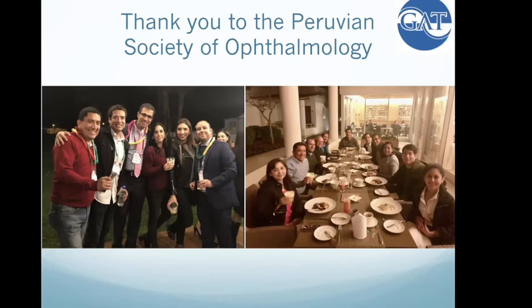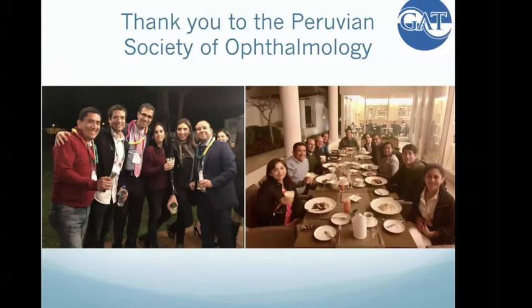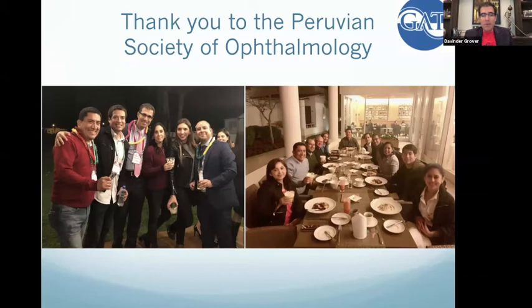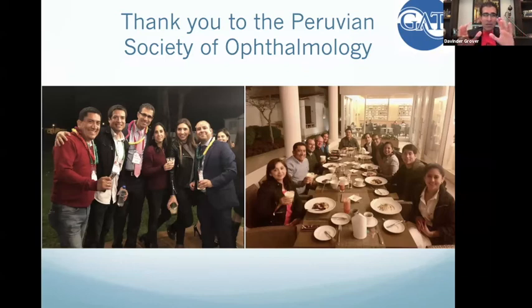Do you mean continuous wave or ECP or micropulse? Usually CPC, not micropulse, just traditional continuous wave CPC. The micropulse, I'm still trying to play with. My biggest problem with micropulse is that I feel like a third of the time it works really well, a third of the time it looks like it hasn't done anything, and a third of the time the eye looks really angry and inflamed and upset. We're still playing with our settings and trying to get a sense. So I still think that after a tube, the CPC diode, the continuous wave, in my hands, is a more predictable way of getting the pressure down.